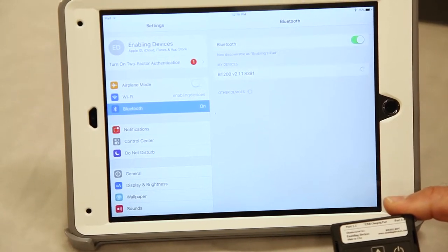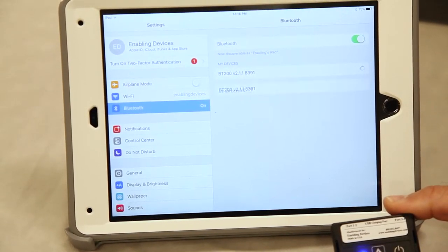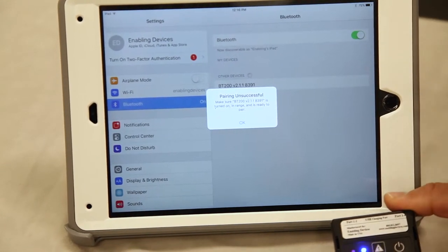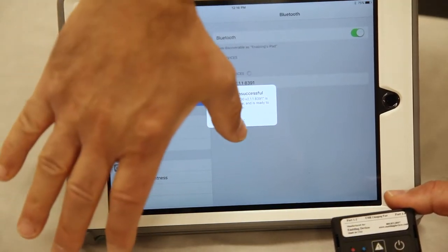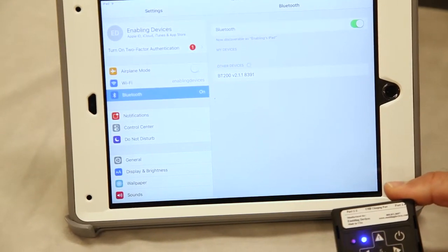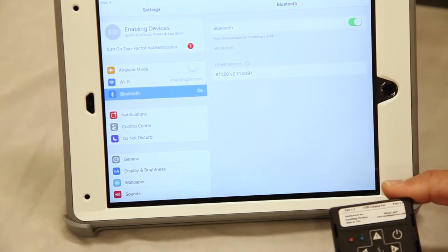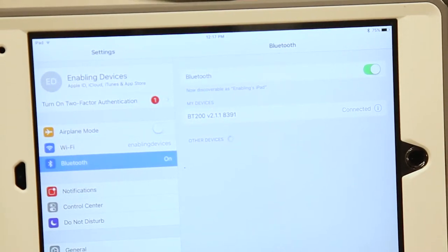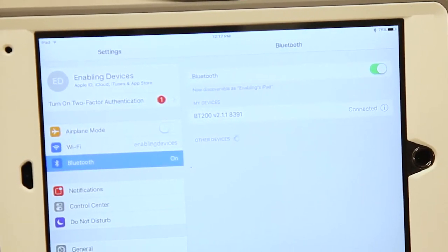Once you see that, tap on it. It's going to take a second or so. It'll ask if you want to pair. Click OK or tap OK. Okay now it shows it's connected.